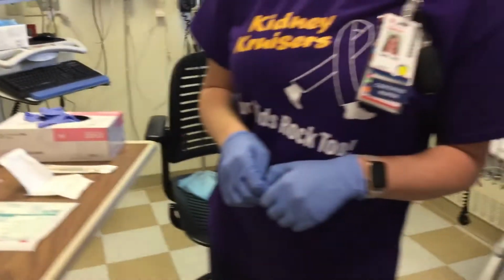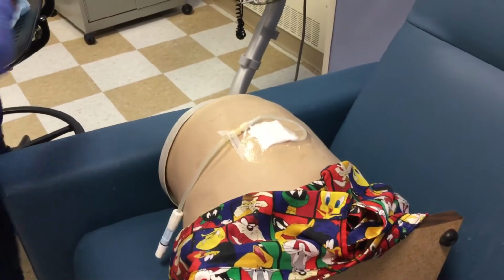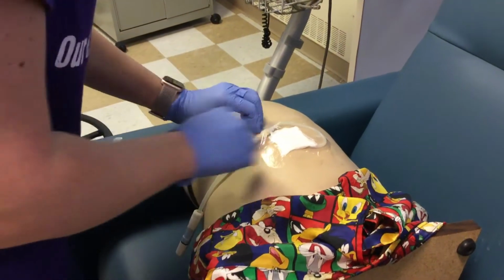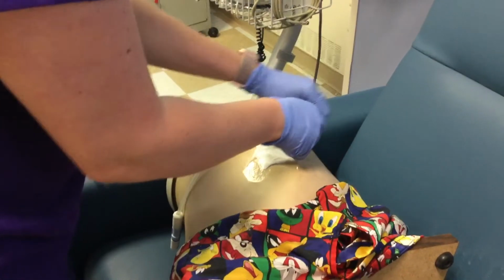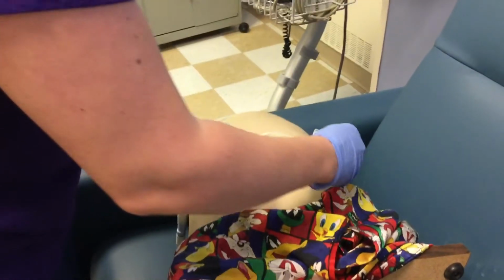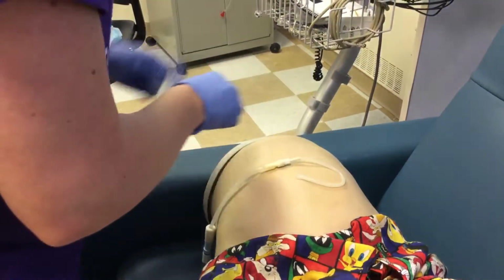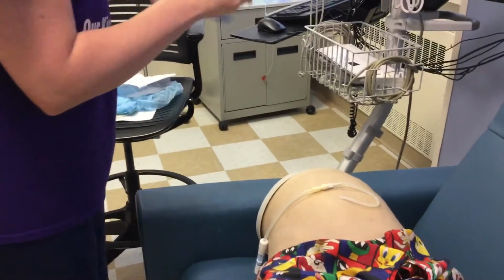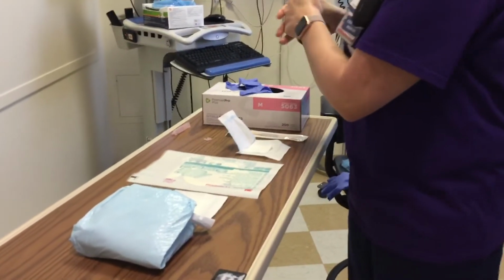Next you will have on just regular clean gloves and you are going to start by removing the dressing. You will then discard the dressing and your gloves away from your sterile, clean area. Next, you will perform hand hygiene.